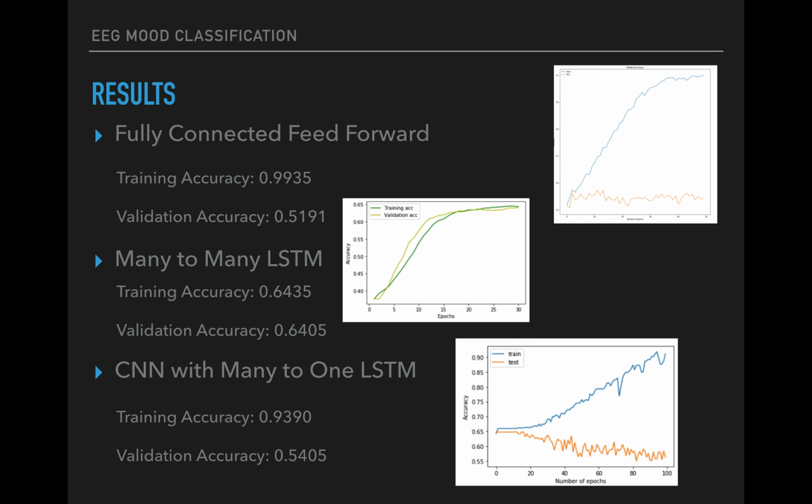Future improvements to this project would include cropping out artifacts, filtering frequencies to ignore unwanted noise, and trying more different models. Despite our poor accuracies, this project laid the foundation for any form of EEG classification. This could easily be extended to classifying other brain states once a successful network is established.